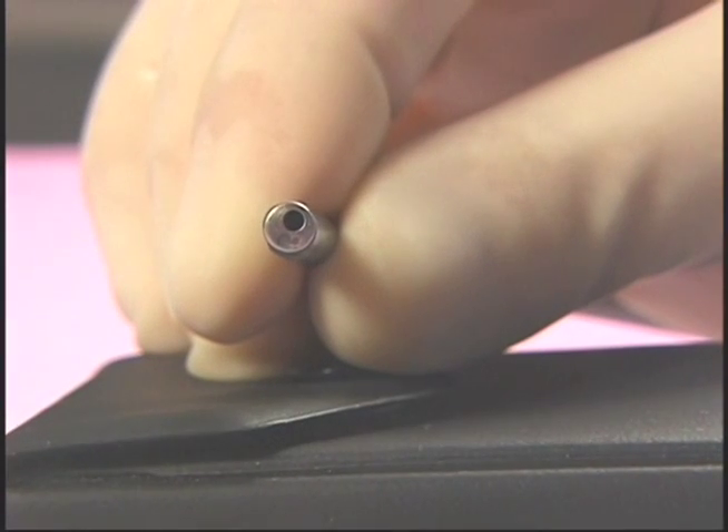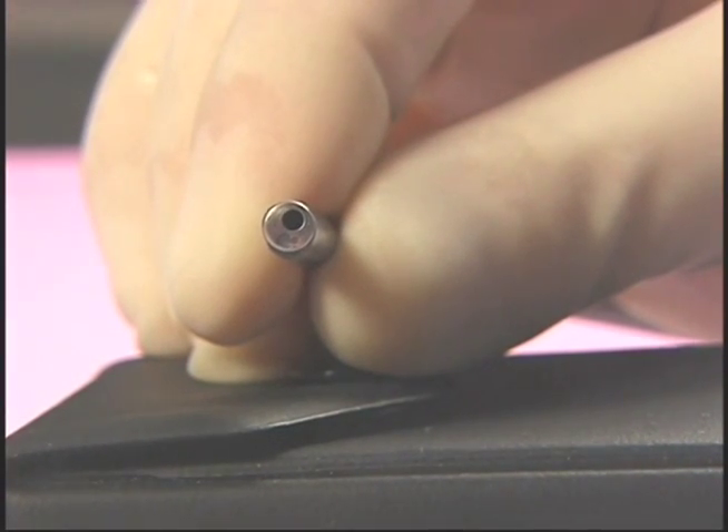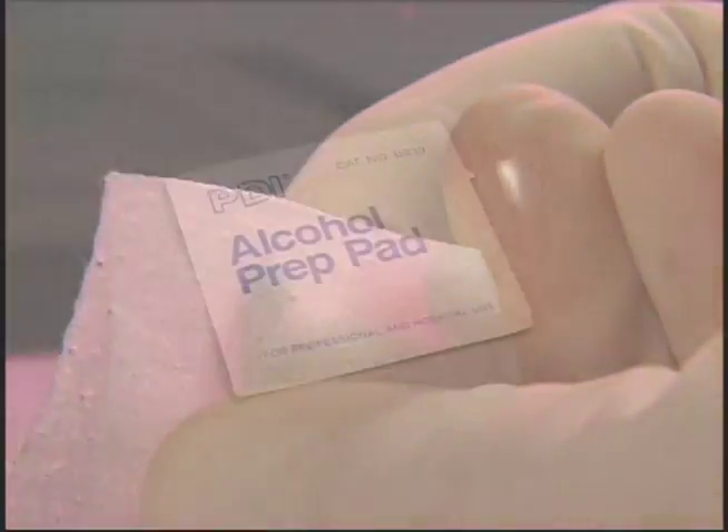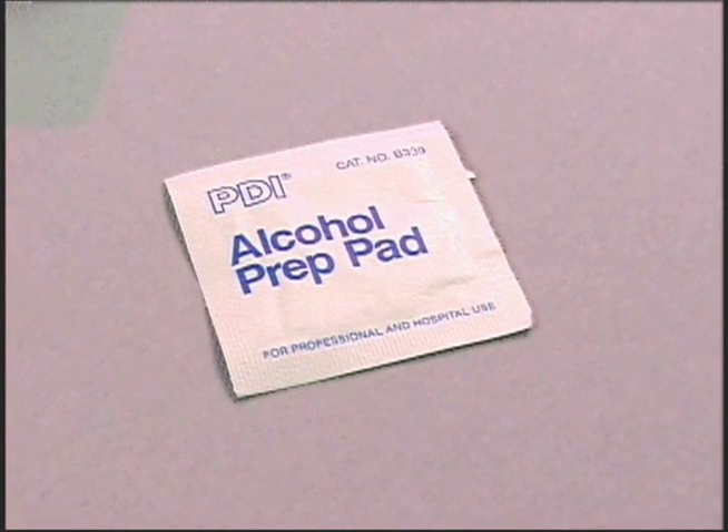Check the objective lens on the distal tip to assure that it's free of fingerprints, smudges, or residue remaining after the cleaning and sterilization process. If necessary, gently clean the distal tip with 70% isopropyl alcohol. A clean lens gives a better image to the physician.